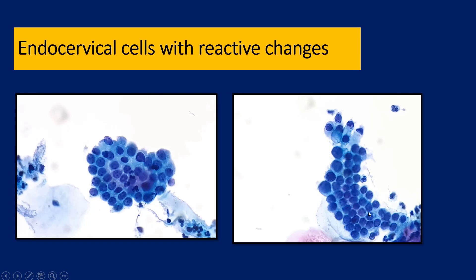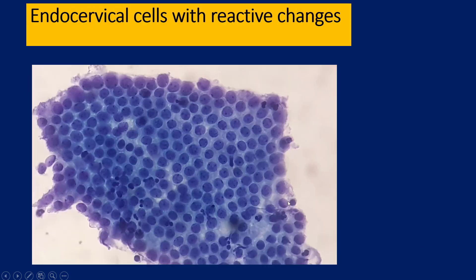Chromatin is pretty evenly distributed; there may be prominent nucleoli — that is something very important. Multinucleated giant cells may be noted. Endocervical cells with reactive changes: when there is reactive change, the amount of mucin may reduce. Cells can get a bit of a hyperchromatic appearance, and there is a bit of overlap. But overall, the honeycomb pattern is maintained. Here you can see a bit of anisonucleosis — this actually looks a little bit scary, but you can see the very well-maintained honeycomb pattern. These are endocervical cells with reactive changes.